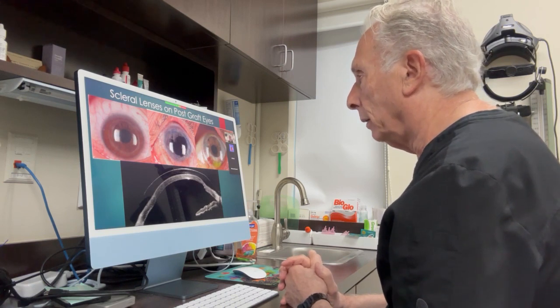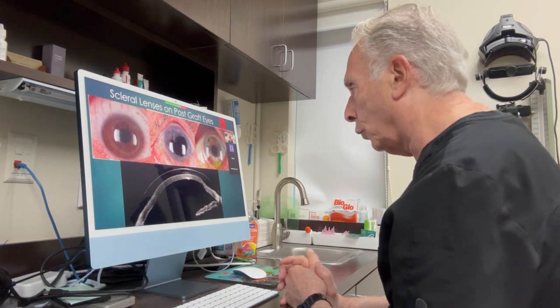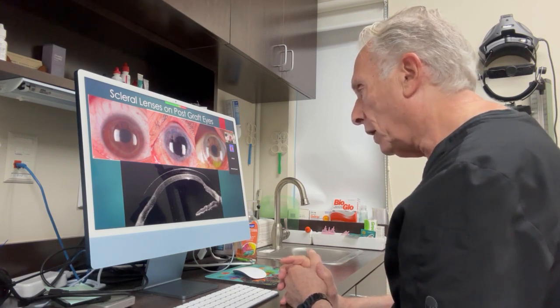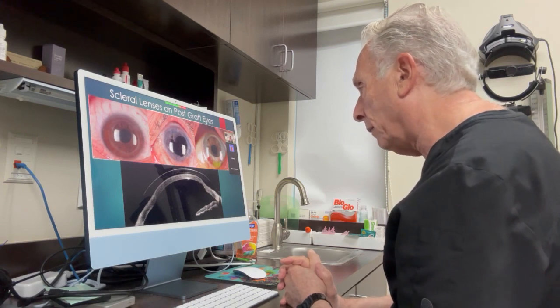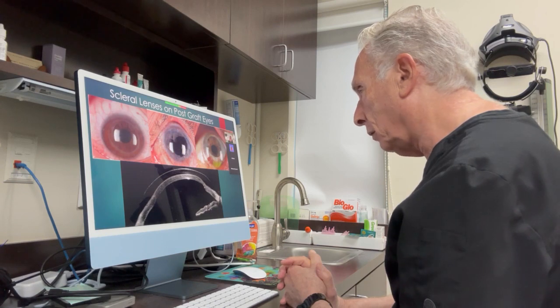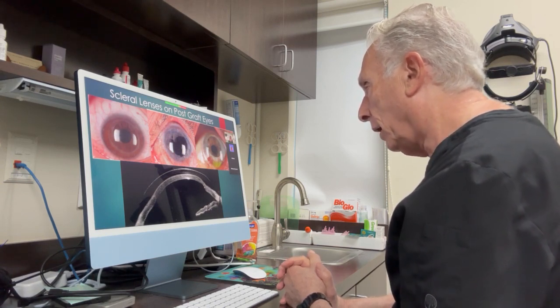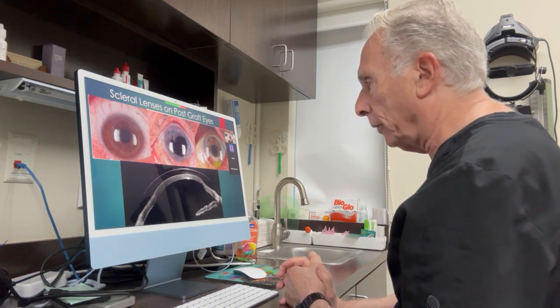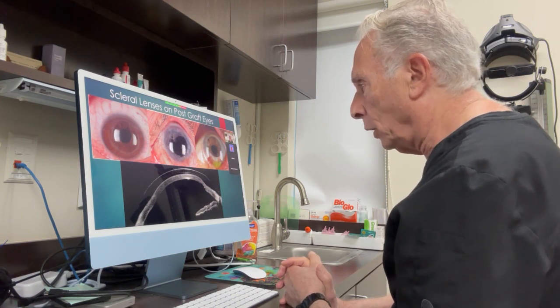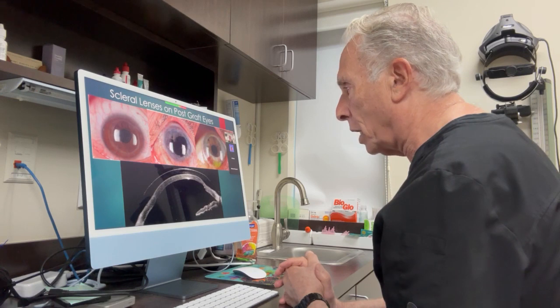And again, very often I've noticed that when you're dealing with a transplanted cornea, you're going to see a tilt. Look at the outline of the OCT image below. Notice how there's a tilt there. And you fit this eye with a regular scleral lens, and maybe it touches one area or rubs against one part of the cornea, and you have clearance in another part. Well, I don't want rubbing on a donor cornea because I don't want to take a chance on any rejection.